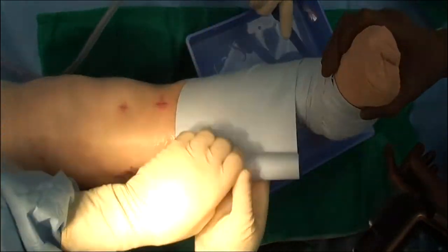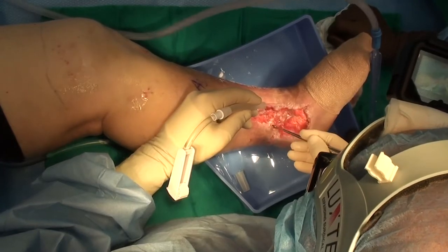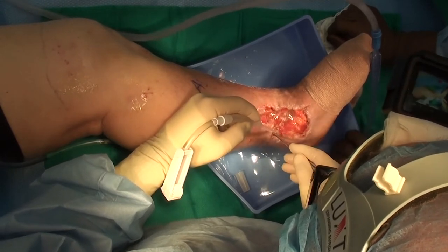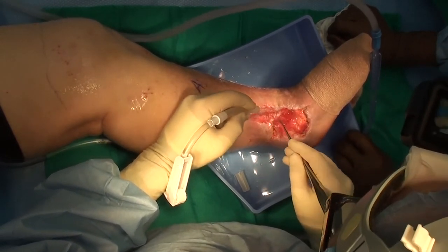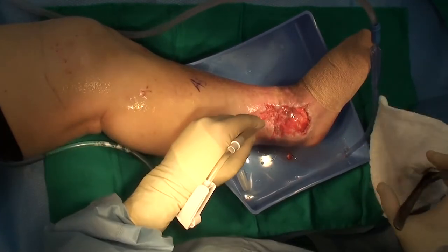We place a sterile tourniquet around the thigh and inflate it to 250 millimeters of mercury, and then perform an extensive irrigation and debridement of the recipient site, carefully debriding all remaining non-viable tissues. We send tissue cultures to rule out infection and help guide potential antibiotic treatment.